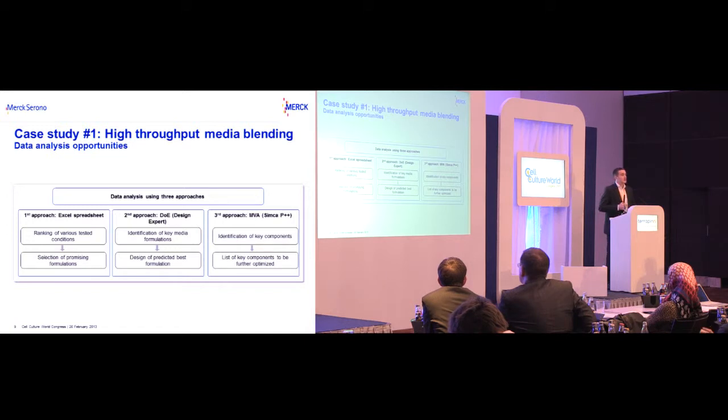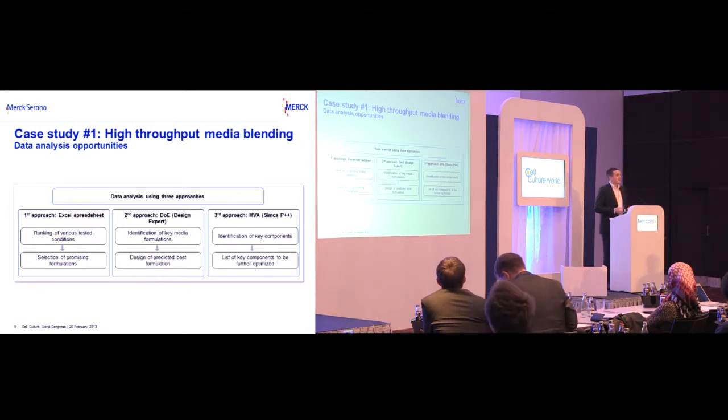To analyze the data, we used three ways of analysis. The first way is quite simple. You take your results, you rank regarding titer, IVC, viability, and you identify the best condition to go further. So you just select your best result.